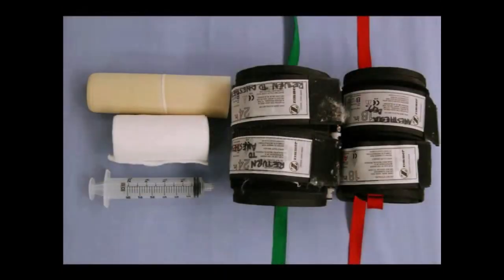Before starting the procedure, identify all equipment and check to see that it is functioning properly. For the Bier block, you will need a Coban, a 5-inch Esmarch wrap, a 50 milliliter syringe of 0.5% lidocaine, and a double cuff tourniquet. The tourniquet is available in different sizes, so it is important to choose the size that best fits your patient.